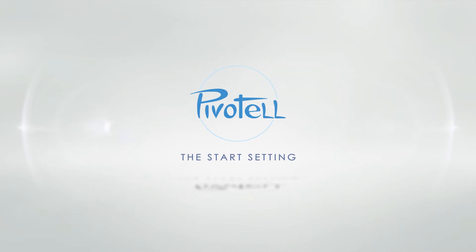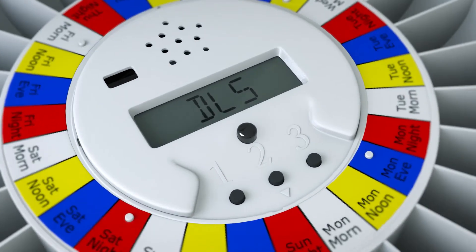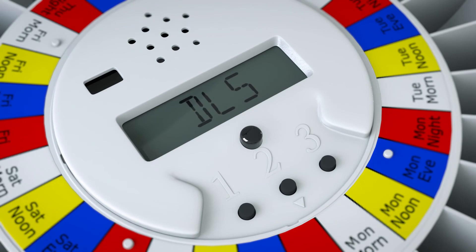The start setting allows you to delay the start of the dispensing cycle until a future day and time. This is very useful for pharmacists who may pre-fill the dispenser in advance. If start delay is not required, set to a date in the recent past.